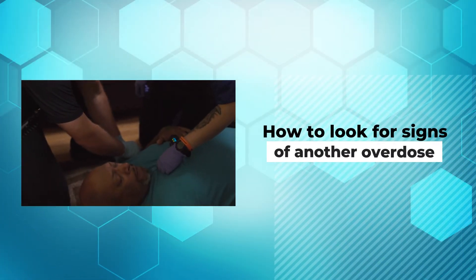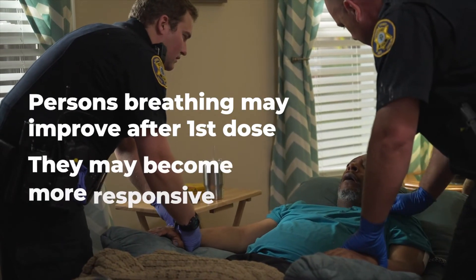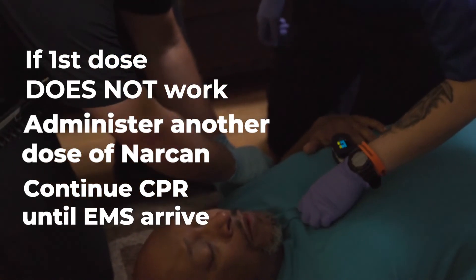After about four minutes of administering Narcan, the person's breathing may improve and they may become more responsive. If not, administer another dose of Narcan and continue CPR until EMS arrive.